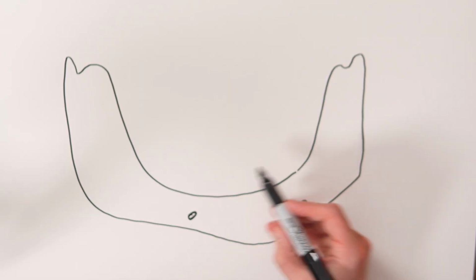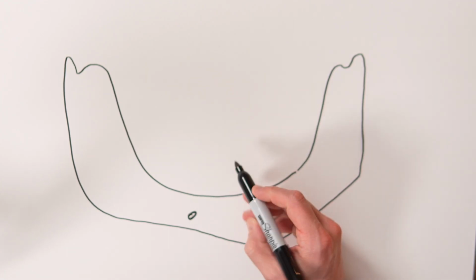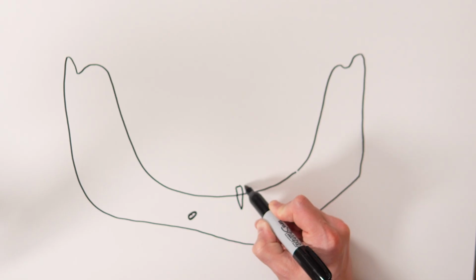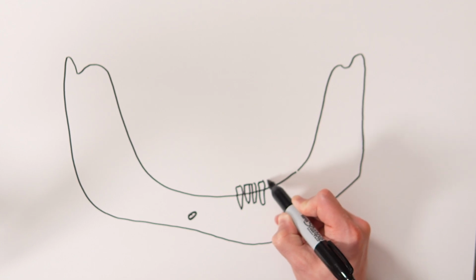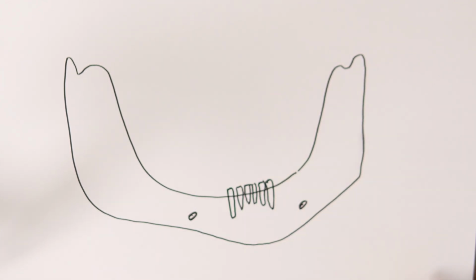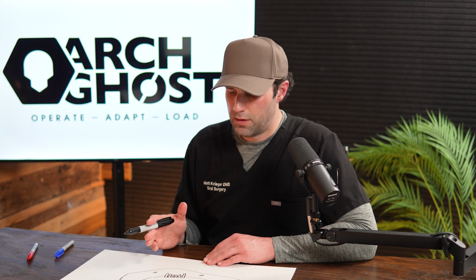The first is the apex of the mandibular central incisor socket. When you see the mandibular teeth, the central incisor sockets, that's maybe lateral, maybe central, lateral, and then we'll say canine, something like that. So almost always, now never say always, right?